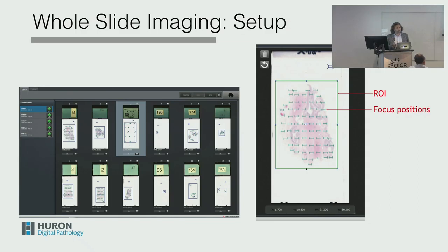So if I get the glass slides and I put them in the microscope as the pathologist, I can play and go back and forth between different magnifications as much as I want until I see the information that I need to see. But if it is software and digital pathology, that happens in the lab. The pathologist is usually not in the lab most of the time. The histotech is in the lab. So things will get shifted, workflow will change. And this is another reason for people to be cautious. Everybody wants to make progress, but the question is, okay, what would it take to do that?